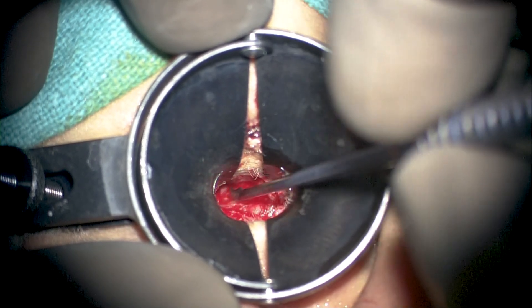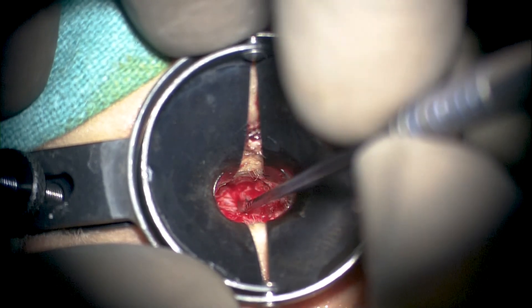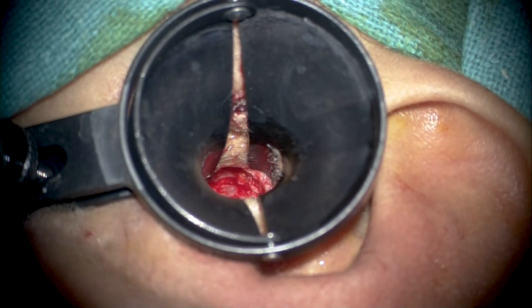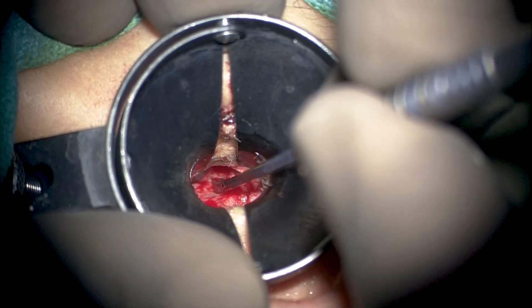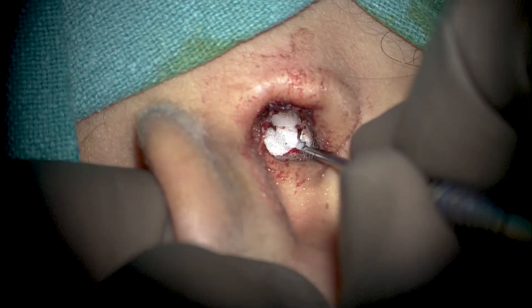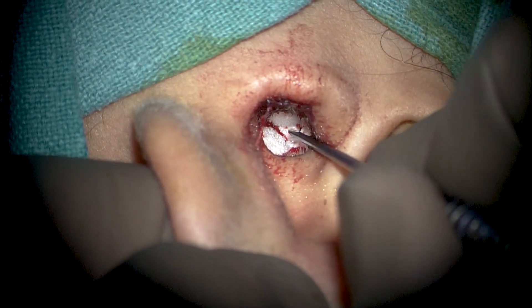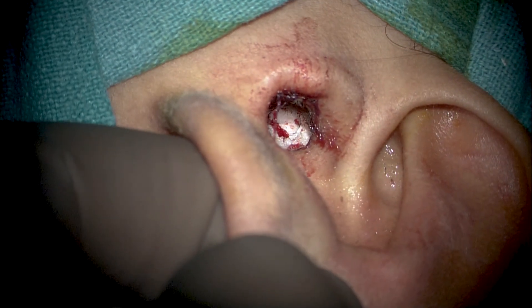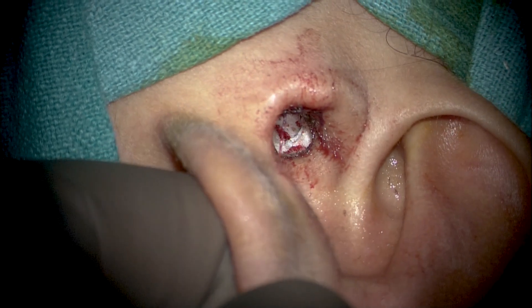Normally we do not use any cotton or gauze packs. We fill the external canal from the tympanic membrane to the meatus with first dry followed by medicated gel foam. Around one week to ten days post-surgery, the patient can initiate putting ear drops over the gel foam, followed by actual gel foam removal only six to eight weeks later. This is a minimally invasive approach towards excision of limited retraction pockets.